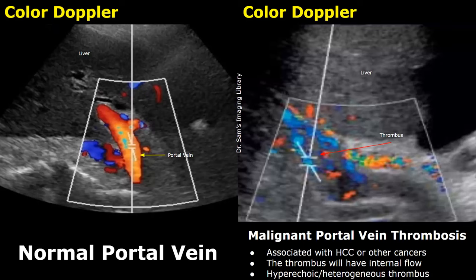Cavernous transformation is the term given to the formation of collaterals around the portal vein. This can occur in chronic cases of portal vein thrombosis.